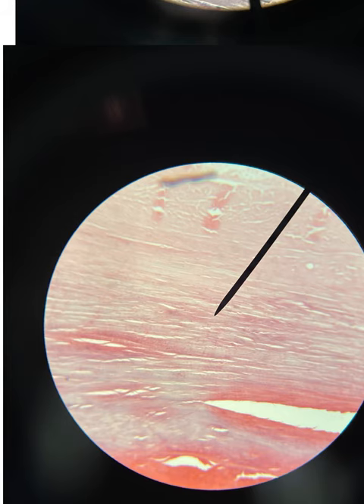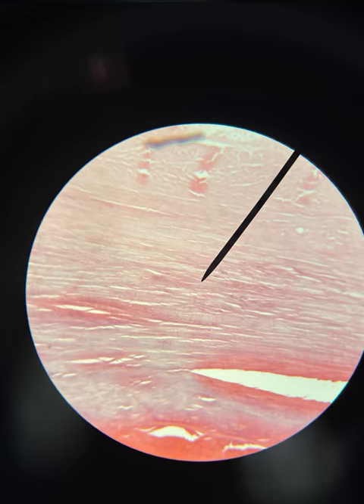Okay, and this, remember I said we would come back to it. This is also fibrocartilage. So I'm going to go back and show you the other fibrocartilage. Now you can sort of see the fibroblast in here. But you can hardly see them. The chondrocytes and the lacuna, let me get my pointer. You see, like right here and right here, and right here, and right here, and right here. But it still has this kind of wispy appearance.